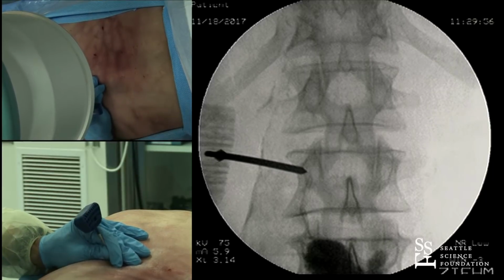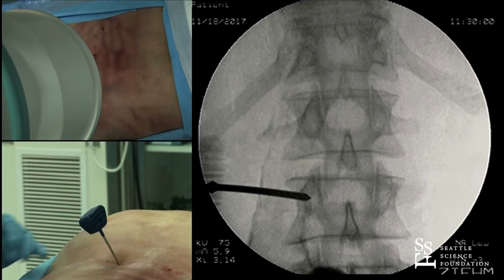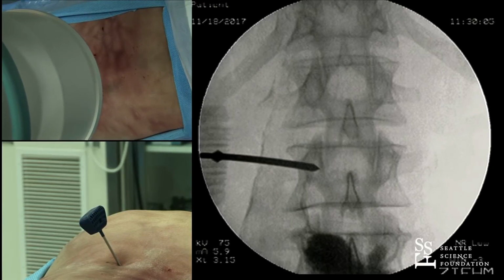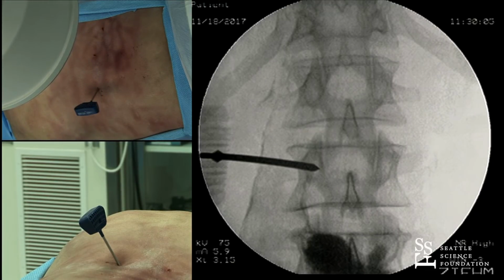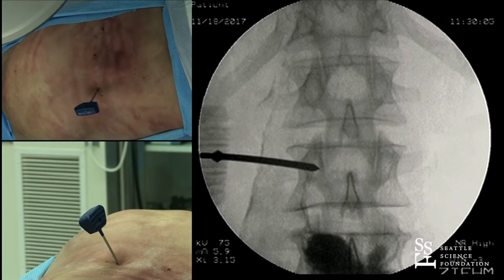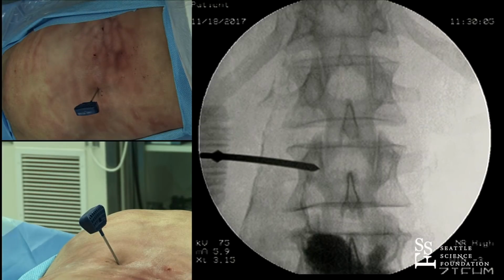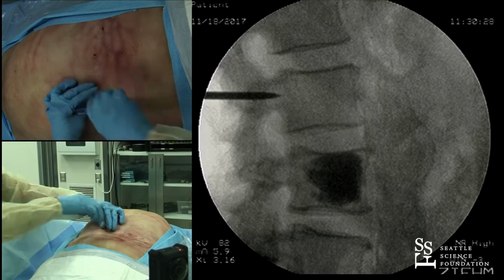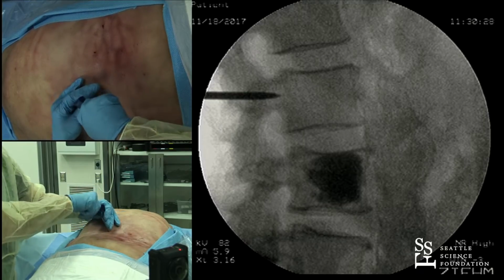All right. So before we violate the medial wall of the pedicle, let's check, make sure we're in the posterior portion of the vertebral body. So if he had marked that with the thickness of his finger, put a mark on the top, and then driven it down to the skin, he should be at the posterior longitudinal ligament level now that he's at the medial wall. So we're a little short. What I'm going to do is pull this back. Let's come back AP and let's have a trajectory lesson.